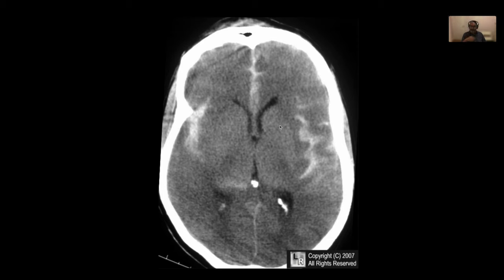Okay. Now this looks normal, but you've got all these. Okay, good. You've got your white stuff, extra white there, some more extra white here, some white there. All the extra white is blood. So this is subarachnoid. Subarachnoid is going to diffuse into the subarachnoid space. So it's going to look like this diffuse bleeding. Now for this one, you can't drill a hole. There's nothing you can do about this. You just have to leave it. It settles itself or it'll get worse, but there's nothing you can do. So that's a subarachnoid hemorrhage.